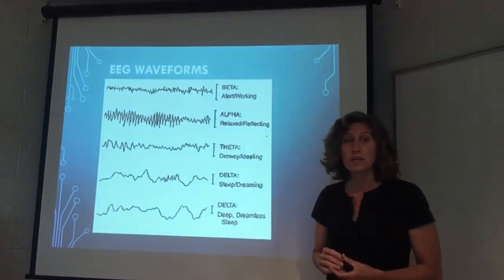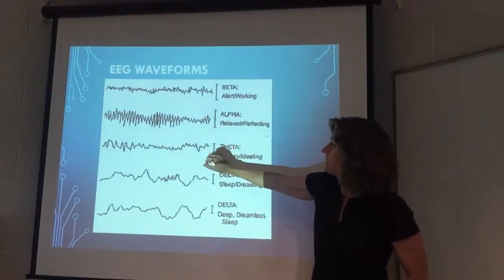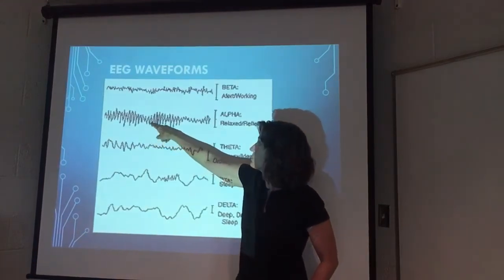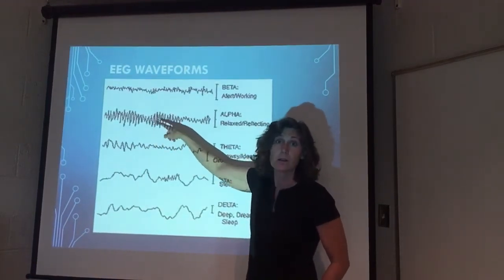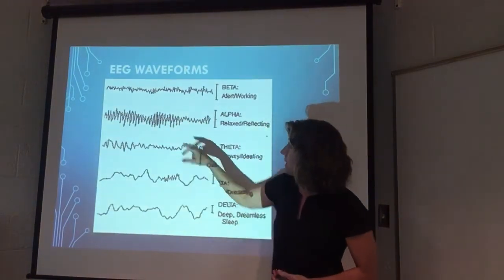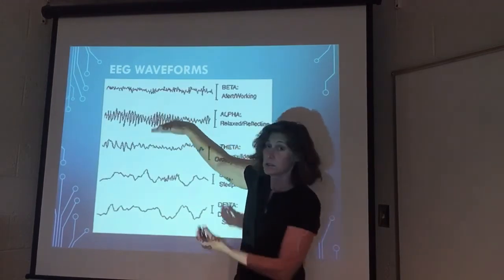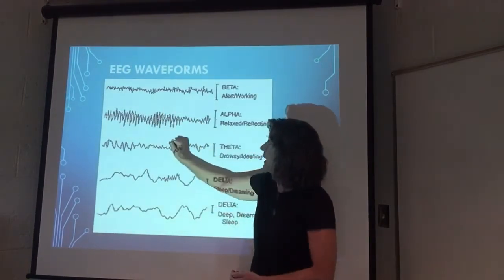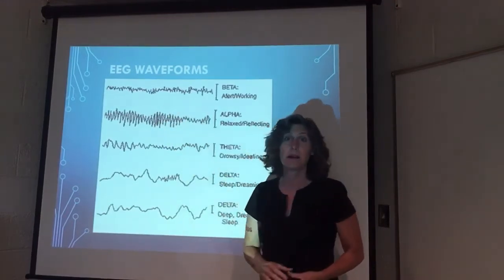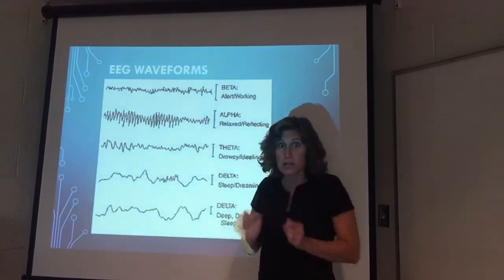So the different EEG waveforms, this is a way of looking at them. Alpha typically has some synchronization to the signal, so you can actually make out actual cycles here. It also has higher amplitude, so they look taller, and they're a little more stretched out than the beta. The beta is this very high frequency, where they're kind of smooshed together.